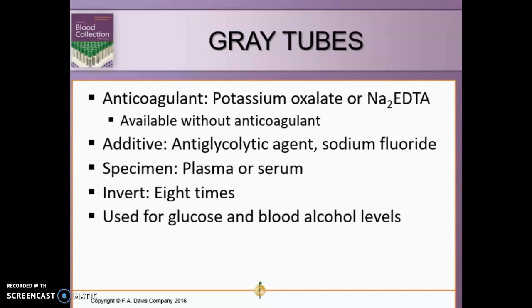Sodium fluoride is not an anticoagulant. If plasma is needed for this, the anticoagulant must be present. So basically, the sodium fluoride in this gray tube preserves the glucose. Sodium fluoride also decreases the microbial growth, which could produce alcohol.